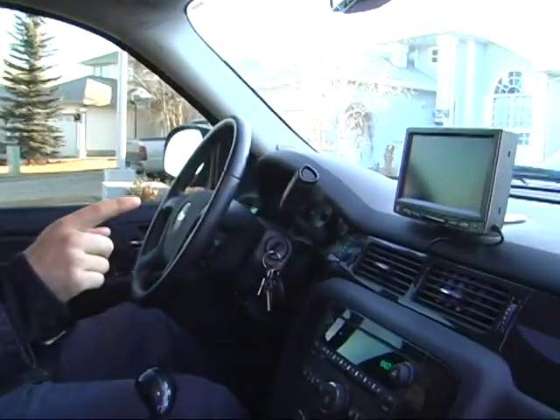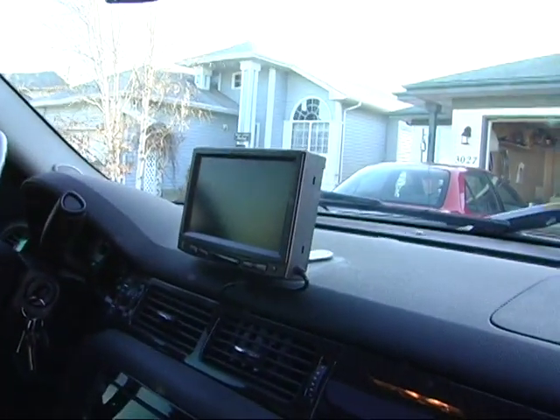Equipped in this vehicle is also a rear view camera. Because the truck is so large and with all the tinted windows, at nighttime you can't see what's behind you. So as a safety feature, I've installed a backup camera so that you can see what is behind you when backing up.